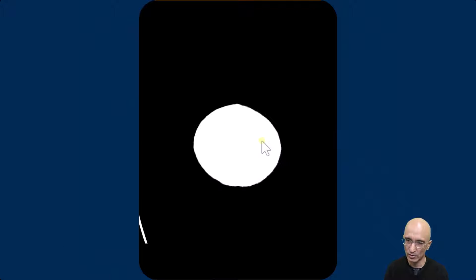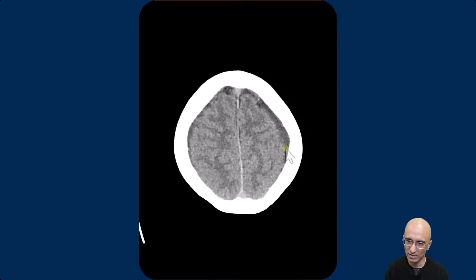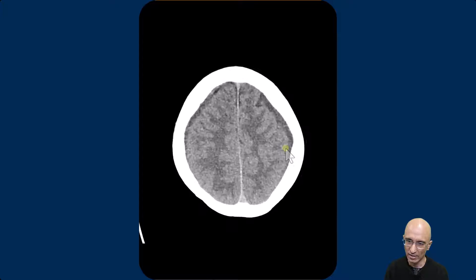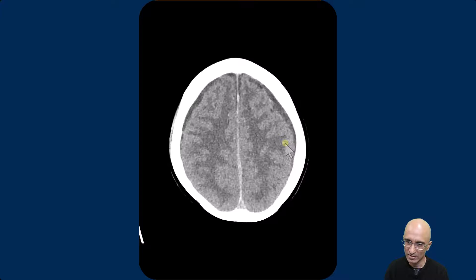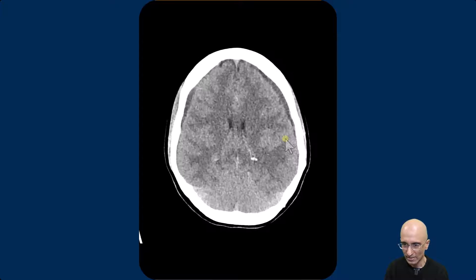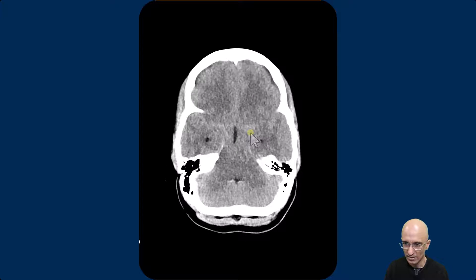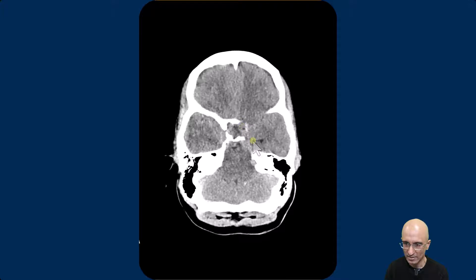I'm going to scroll through the CT head from superior to inferior direction. As you can see, there are hypodense bilateral convexity subdural collections. There is loss of sulci in bilateral cerebral hemispheres. As I scroll down further, there is effacement of the basal cisterns.